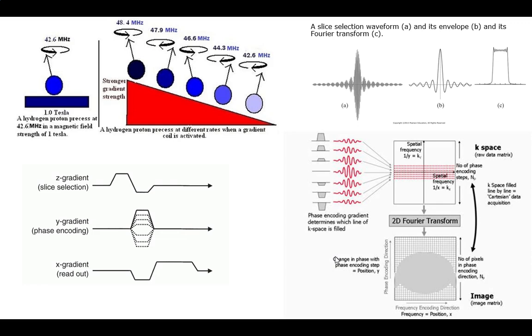So literally, we do this at time 1, set that pulse. Now I'm going to quickly kick the phase, because now that they're spinning, I want to do something to cause them to dephase so I can do the measure out. So I'm going to set the dephasing frequency as it's dephasing. That's why I do the Y gradient next. And then I read it out afterwards.